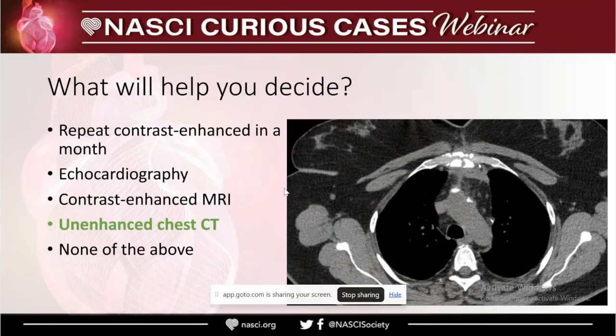So basically the patient was transferred to our institution, and the surgeon said, I don't think it's extravasation, I think it's surgical material. But again, because it's the aorta, you have to prove that, because you don't want to deal with a ruptured aorta on your conscience.